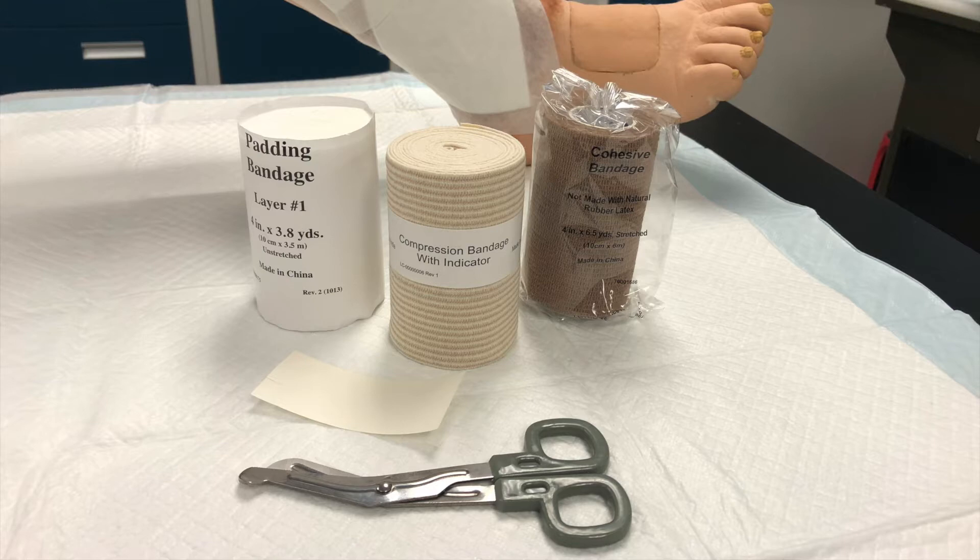3Press should be applied by personnel that has received training on the proper application of the system. Before applying the first bandage, check the ABPI to determine if arterial disease is present. If the ABPI is less than 0.8, do not apply the system.